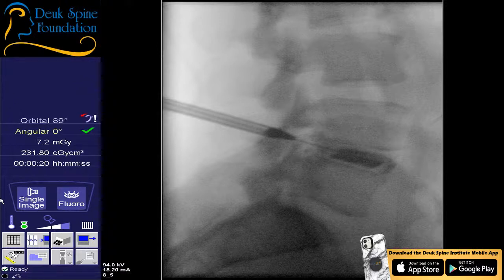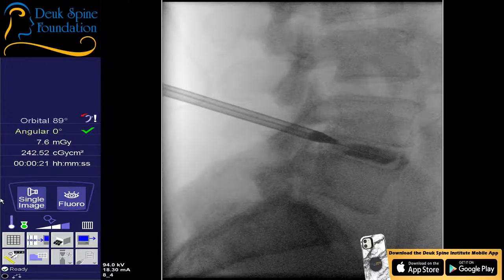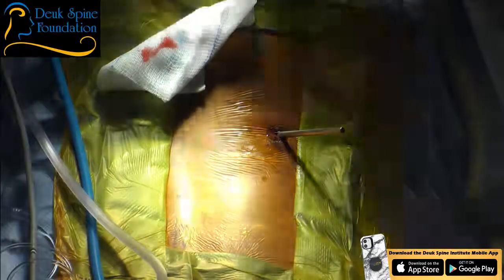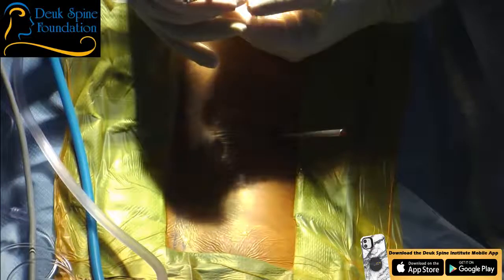Dr. Duke proceeds with dilation, noting the dilator passes very easily into the large annular tear — the bigger the tear, the easier the dilator goes in. He now introduces the tubular retractor, a metal tube made in Germany through which the entire surgery will be performed. He explains this is true endoscopic spine surgery — not percutaneous — using an endoscope with camera, light source, irrigation, and suction. Percutaneous procedures are needle-based; this is a full surgical procedure performed endoscopically.